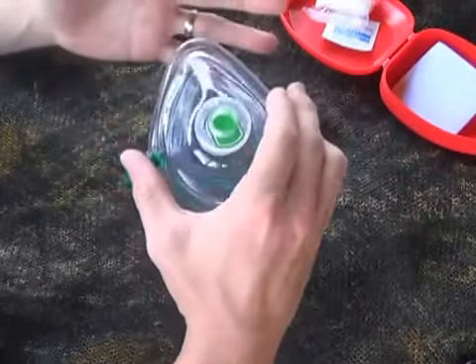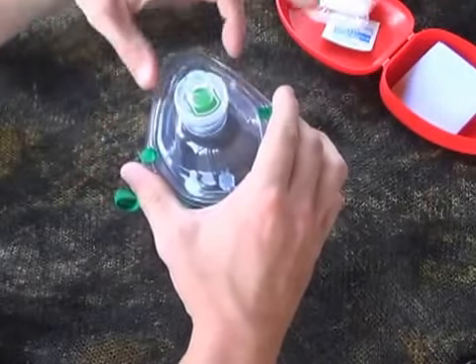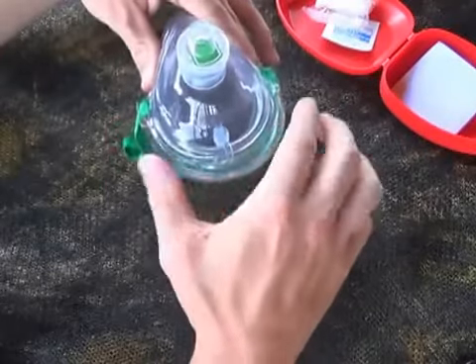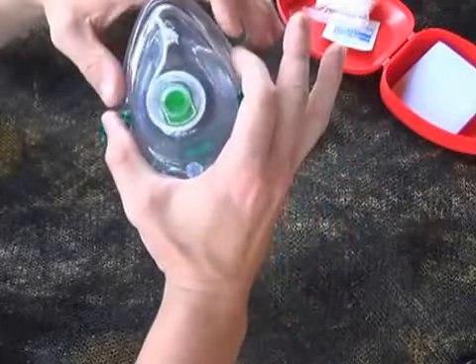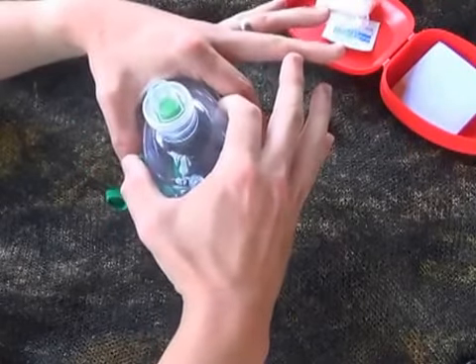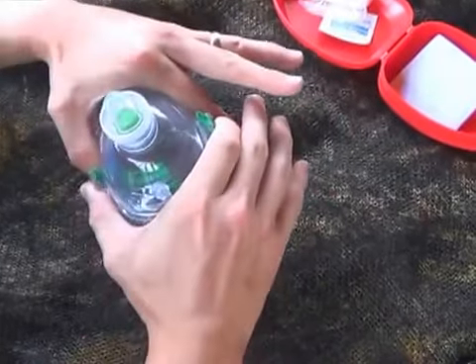There are a couple of different ways you can hold this face shield. If this was the patient's head, their nose is here and their chin and mouth are here — put one hand over their face with this part going across the bridge of their nose, and then blow into it.